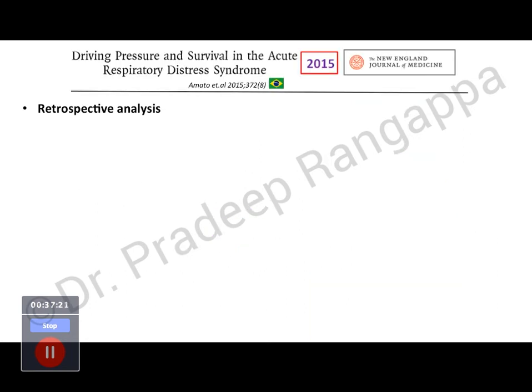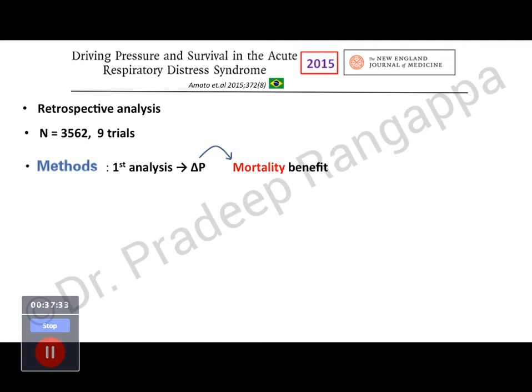So this is a landmark article. We, as intensivists, core intensivists, have learned the concept of driving pressure only in 2015 from this article, which came in NEJM by Amato. It was a retrospective analysis. They took all the 9 trials. What they found is driving pressure had a direct correlation to the mortality benefit, which means you keep the driving pressure low, patients survive better. If you keep driving pressure high, patients can die.